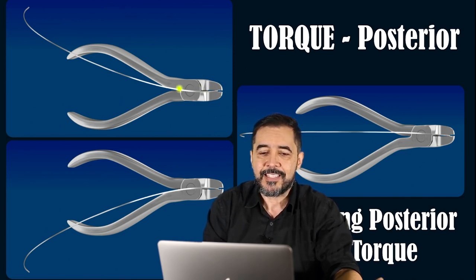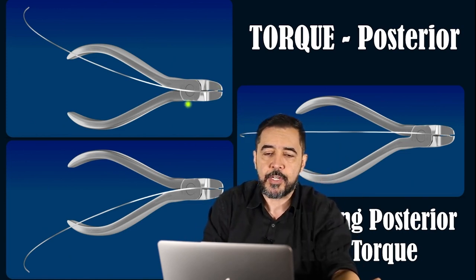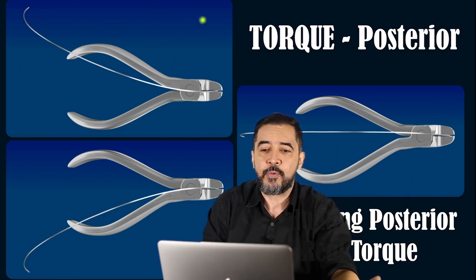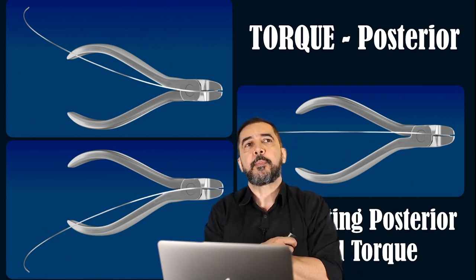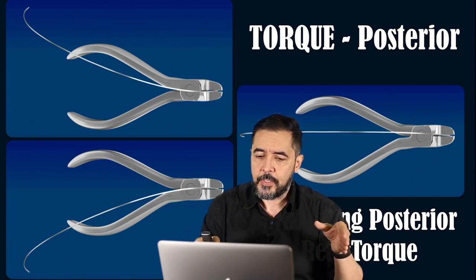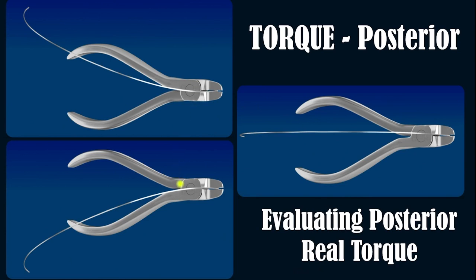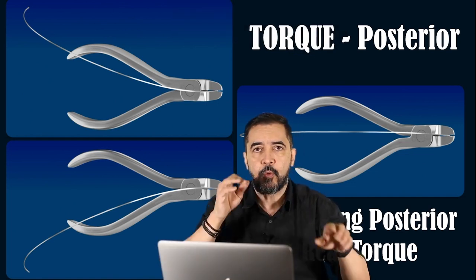So if this is inserted this way in the lower arch wire, we consider this a posterior real negative torque, okay? So what do I have to do, Kleber, if I want to have a posterior torque in the lower arch wire? We invert like this. We go upside down. We put this way, not this way. So we have here, for the lower arch wire now, a positive torsion, a positive real torque, okay?